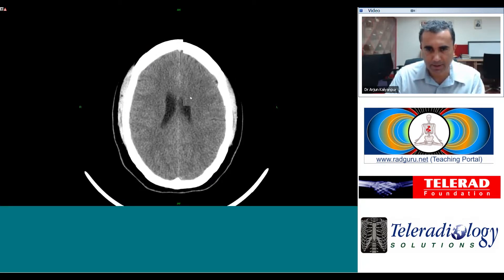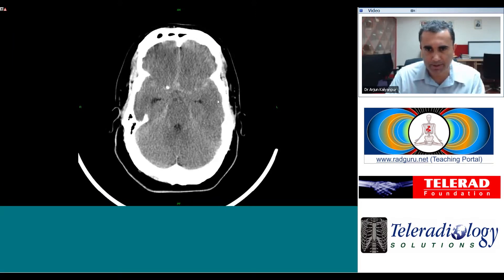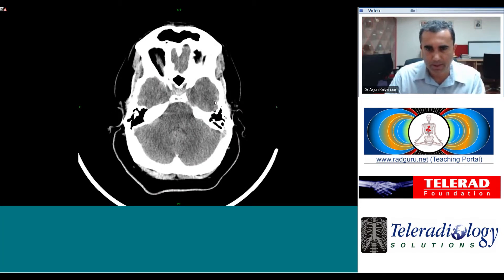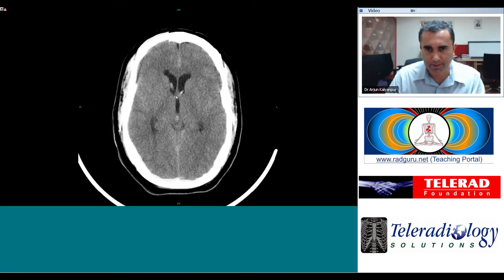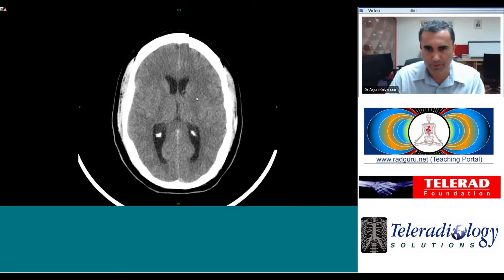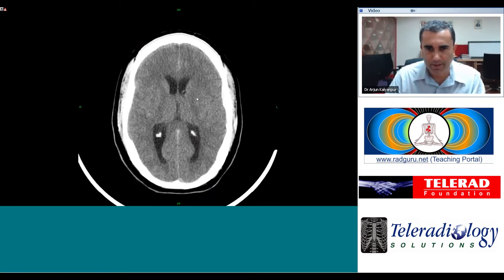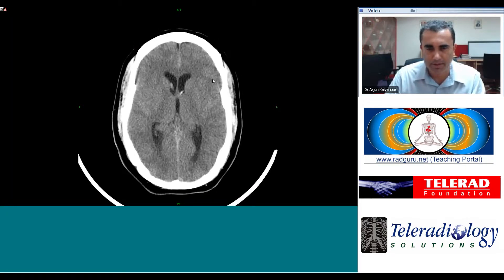This pattern of high density material within the sulci is characteristic of subarachnoid hemorrhage. In this case, the hemorrhage has also dissected into the ventricular system. There are small amounts of intraventricular hemorrhage in the frontal horns, resulting in mild communicating hydrocephalus. Note how the frontal horns appear slightly bulbous as a result of the acute onset of hydrocephalus.